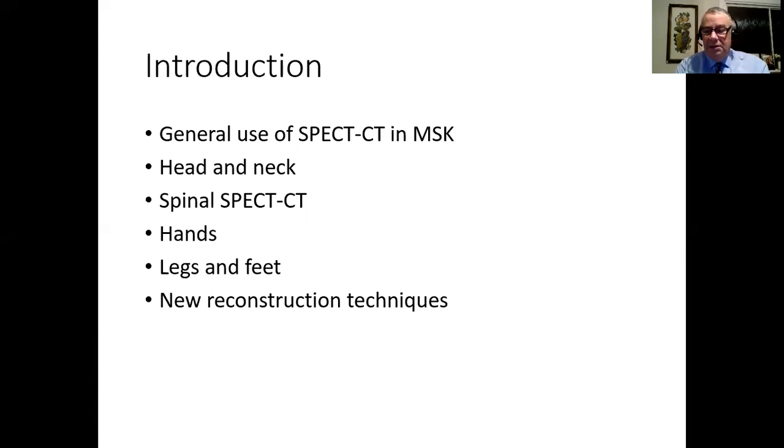So I'm going to talk a little bit about SPECT-CT, very little on SPECT-CT and MSK. I mean, we know why SPECT-CT is so useful. And then we're basically going to go down the body from head to feet. And then at the end, I'm going to talk about some new reconstruction techniques that are just arriving. In fact, whilst I'm speaking, the hospital I work at in London now has just bought one of these new machines that's been being tested by our physics team this week, which has these new reconstruction techniques.